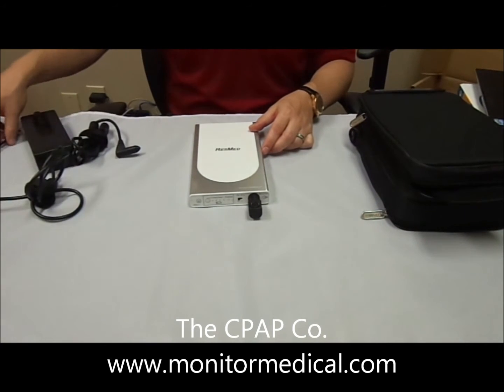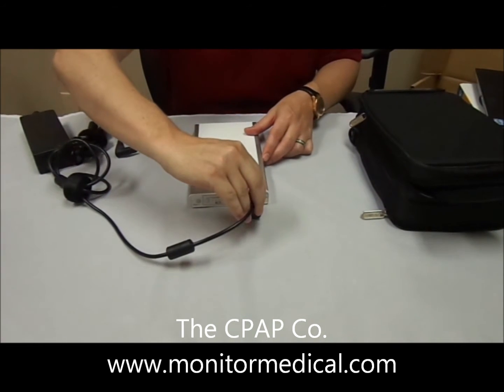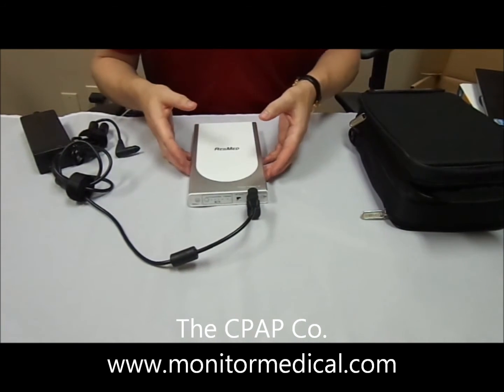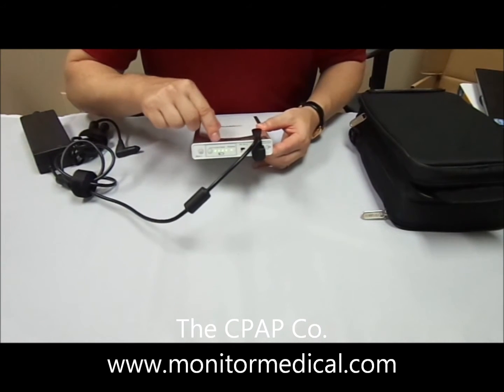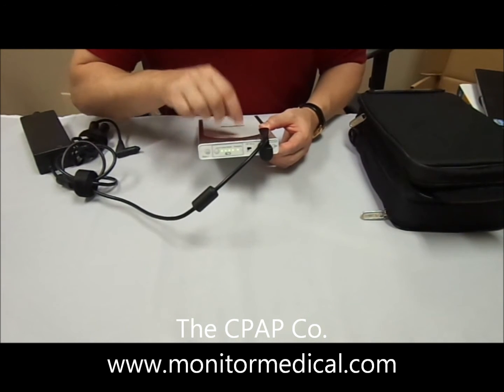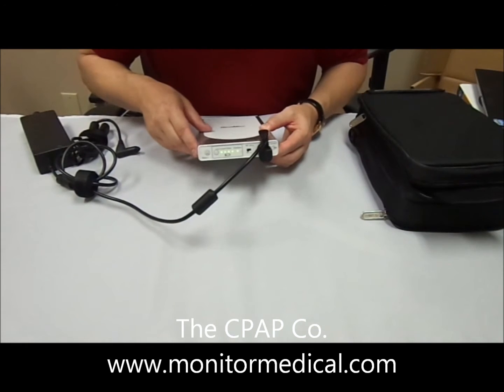Next, take your ResMed S9 power cord — the standard power cord — and plug it into the PSU adapter for charging. Just line up the pins and it goes in very smooth. You'll see in the back: four green lights means over 90% charged. The other green light here indicates full charge — if it's solid, it's at a full charge. If it's blinking, we're not at a full charge and need a little bit more charging.